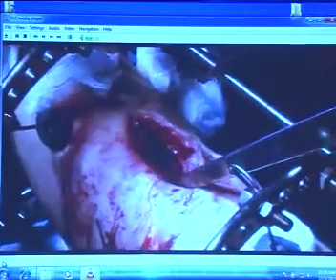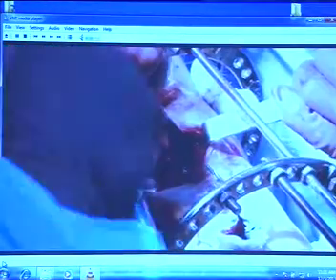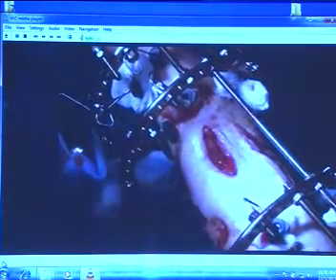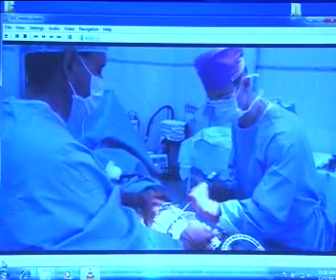Shown is a macroscopic view of the bone excised. After the wound has been cleaned, interrupted stitches are applied. The tibia is osteotomized with a chisel in the upper third out of a 2 cm skin incision for bone transport and limb lengthening.